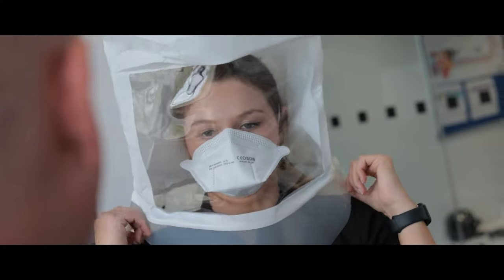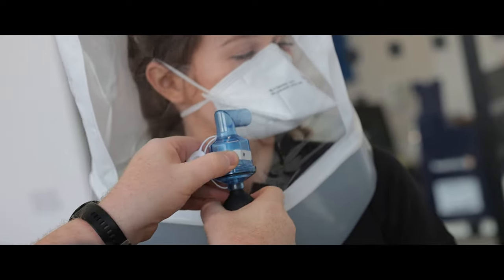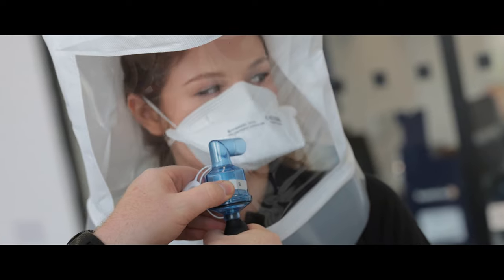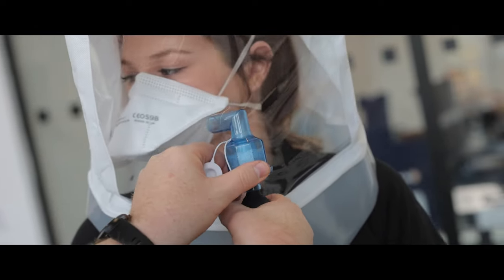There are two types of FaceFit tests: qualitative and quantitative. Qualitative fit testing is suitable for disposable and/or half face masks. This test results in a subjective pass or fail based on whether the wearer can taste a bitter or sweet solution through their mask, which is sprayed into a control hood.